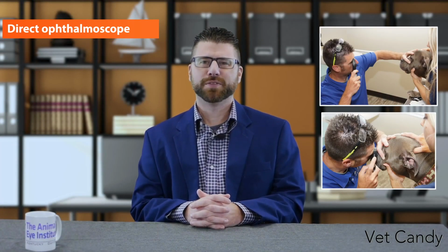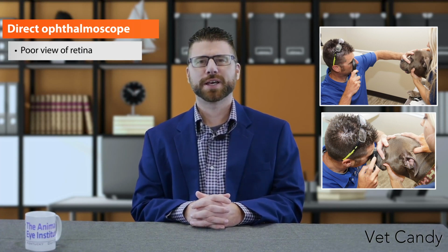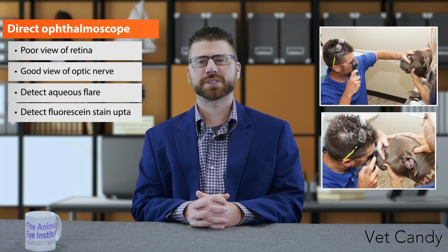So a direct ophthalmoscope is one instrument that is used to evaluate the fundus of a patient. It has a poor view of the retina, about a 5-degree field of view of the retina. It's good for optic nerve evaluation. There's a slit beam that you can use to detect aqueous flare, and there's a cobalt light to detect fluorescein stain uptake. A better view of the retina compared to a direct ophthalmoscope is the panoptic. This provides a 25-degree field of view. There's a better working distance from the patient as compared to the direct ophthalmoscope.